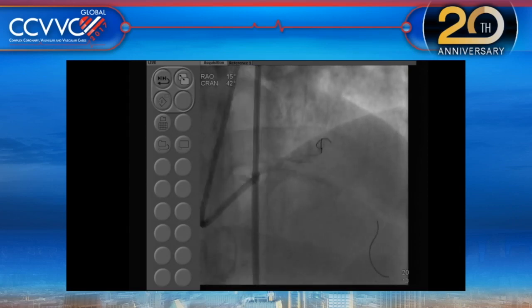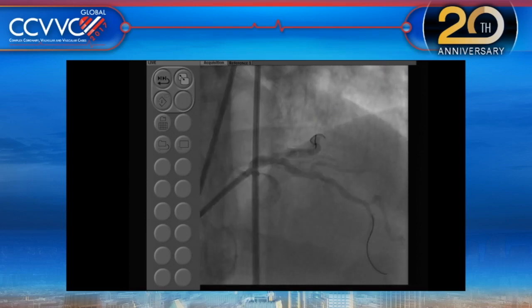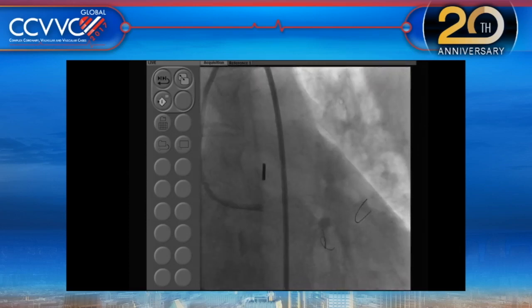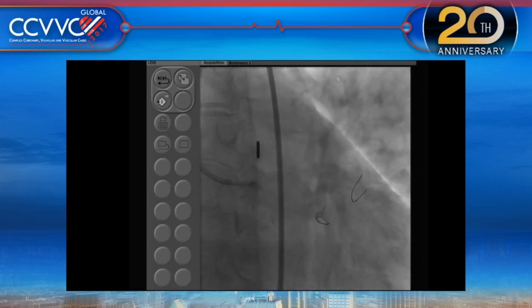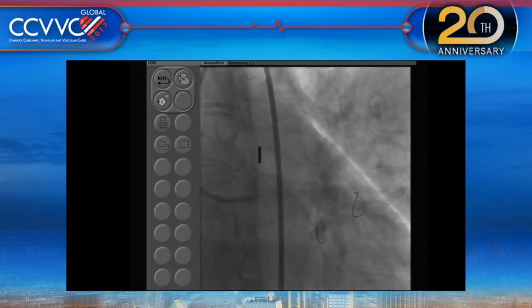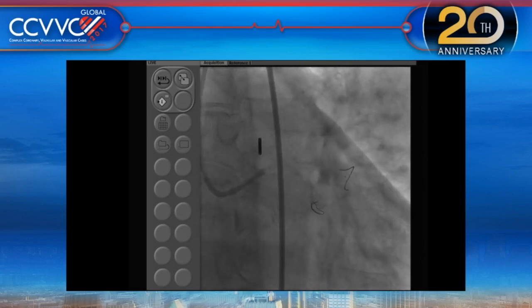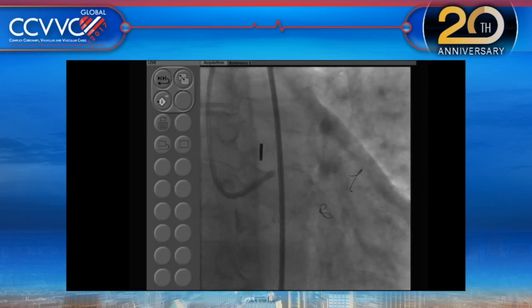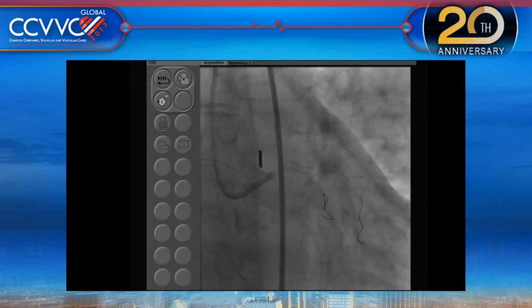We want to go to a caudal view. Make sure the wire is distal, as long as it has crossed that lesion. Are we okay there? No. It crossed the lesion. The stent may not go, the long one. Tell them there's room. It's so tortuous that the wire doesn't want to advance. What's happening with that wire? Maybe you need a new circ wire, the wire is misbehaving.